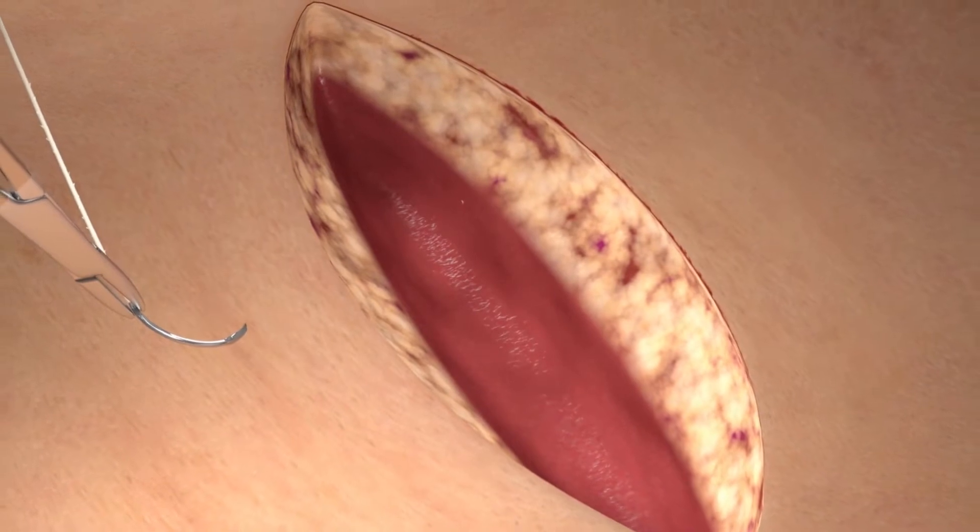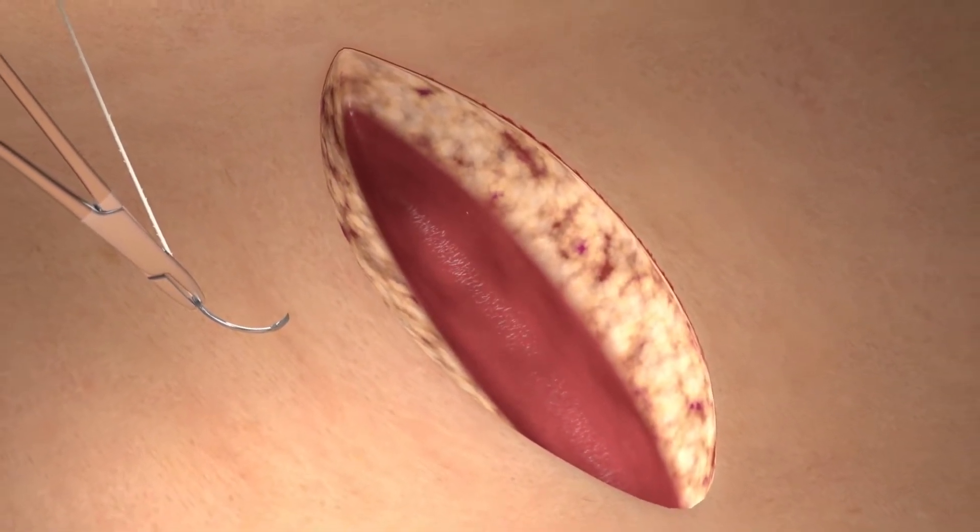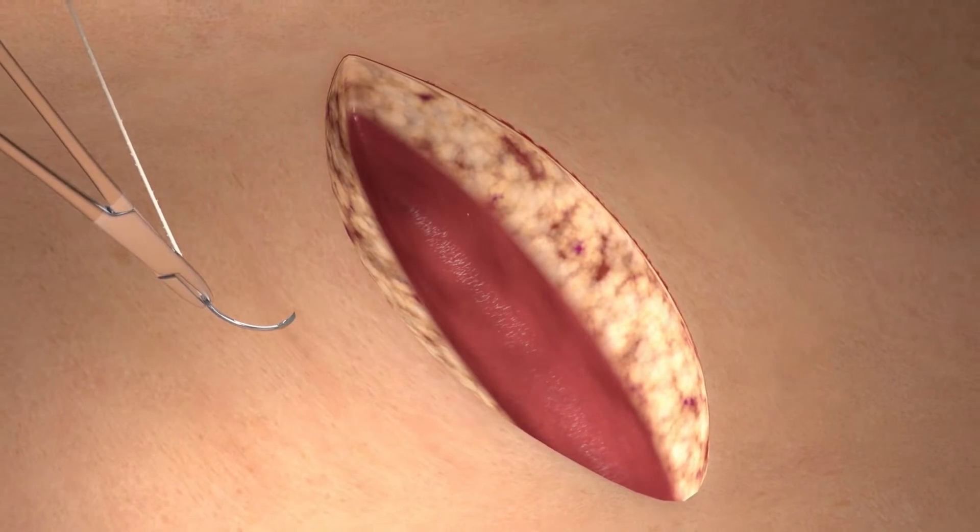Here we are looking at a surgical defect after excision. We will be approximating the deep dermal layer with a Quill Monoderm device.